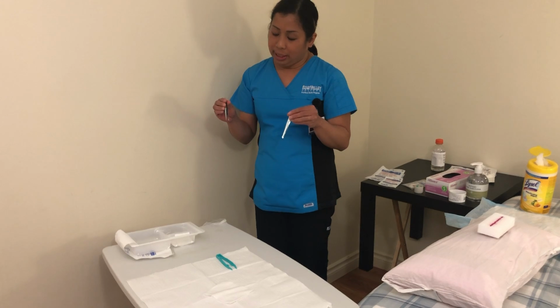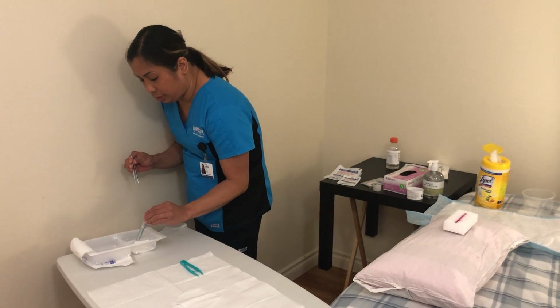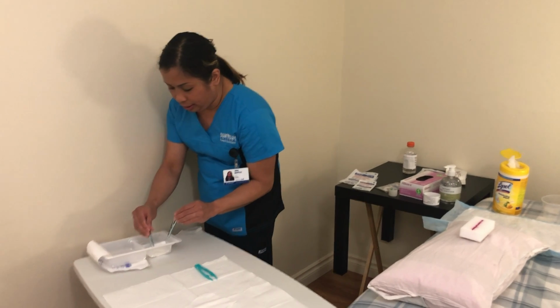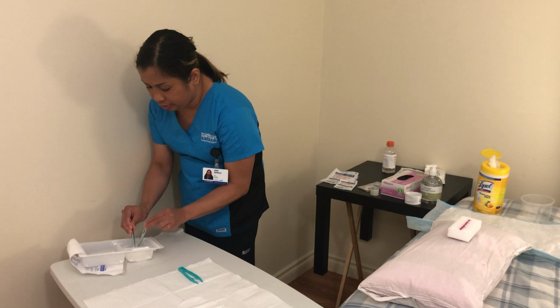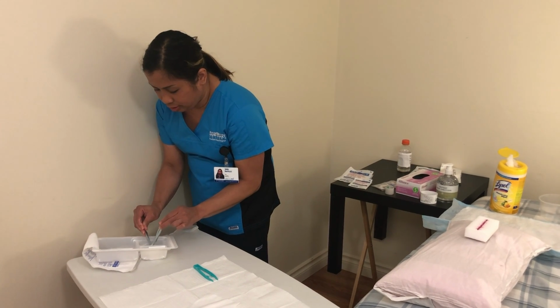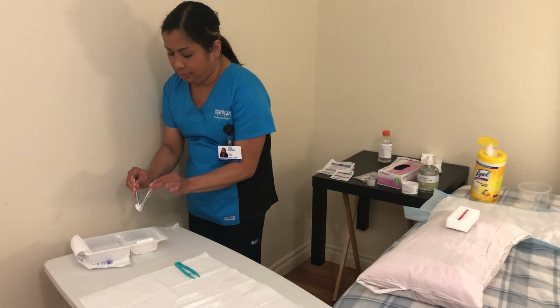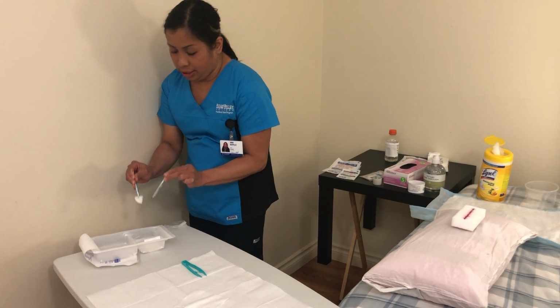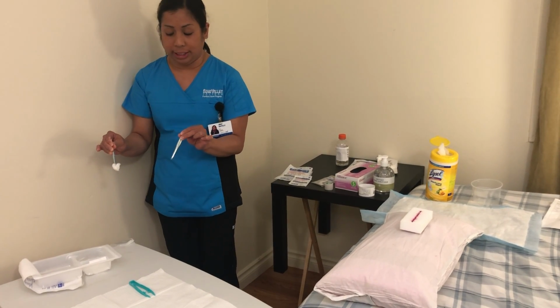So now I'm gonna soak my 2x2 in the solution. Okay, this is my soak. So I'm gonna clean up the wound at the center first.